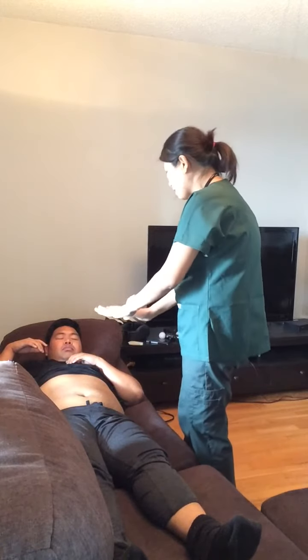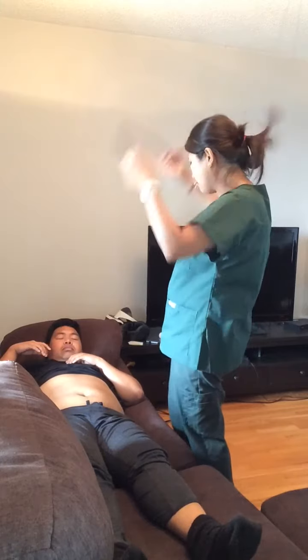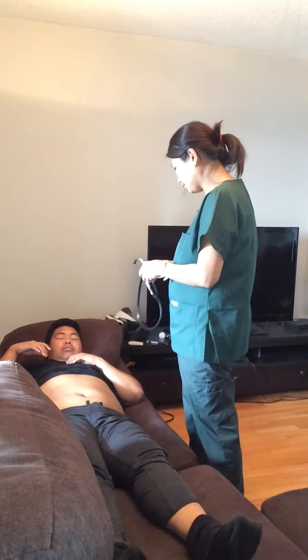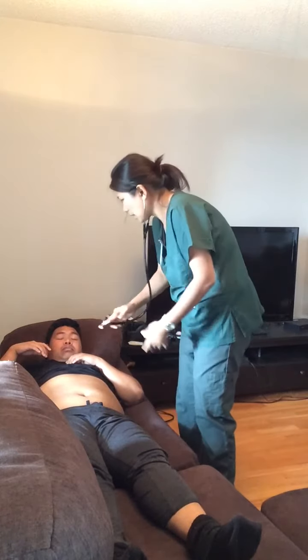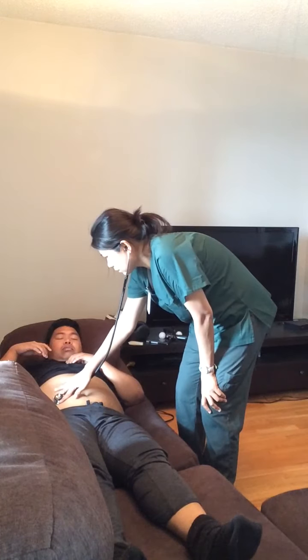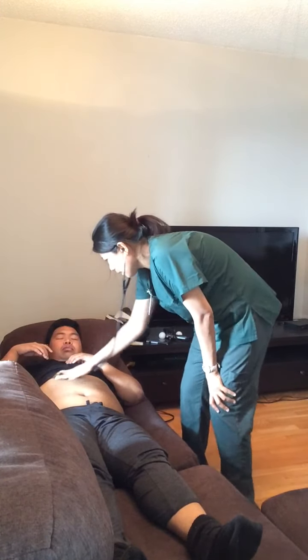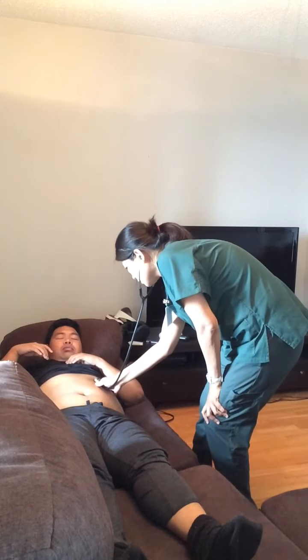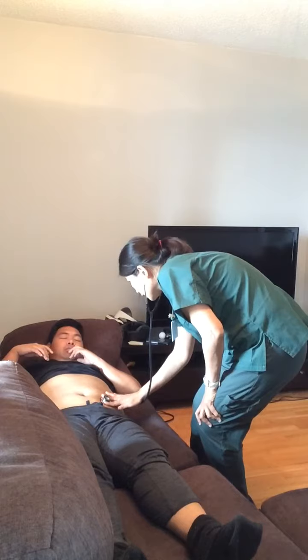So now I'm just gonna listen first to your abdomen. Okay. So I start with the right lower quadrant, right upper quadrant, left upper quadrant, and the left lower quadrant.